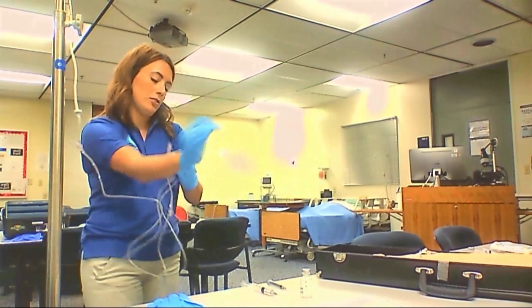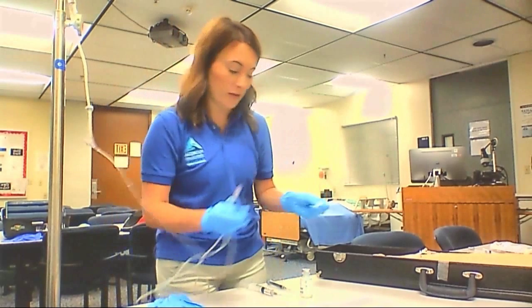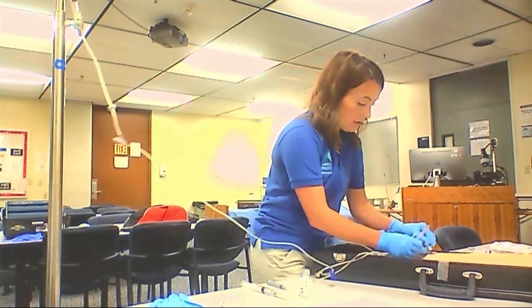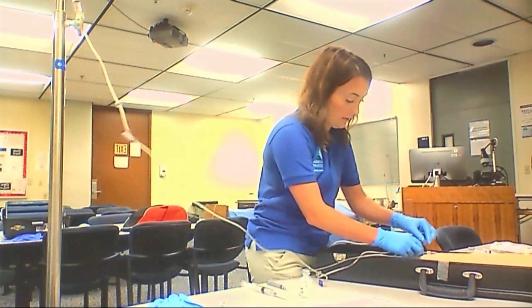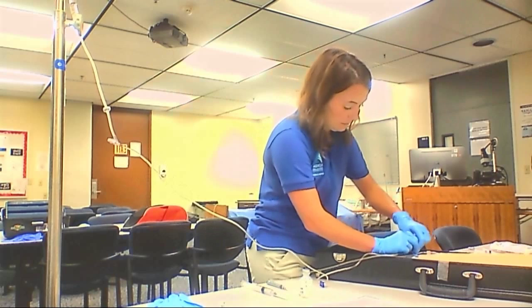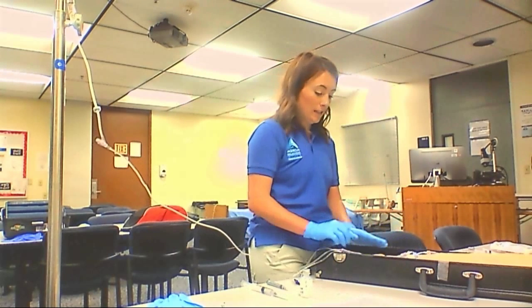Before I attach this to the patient, I again want to make sure that I clean both sites with an alcohol swab, again reducing the risk of infection to the patient via an IV line. Okay, so I've identified my client again like I did before.